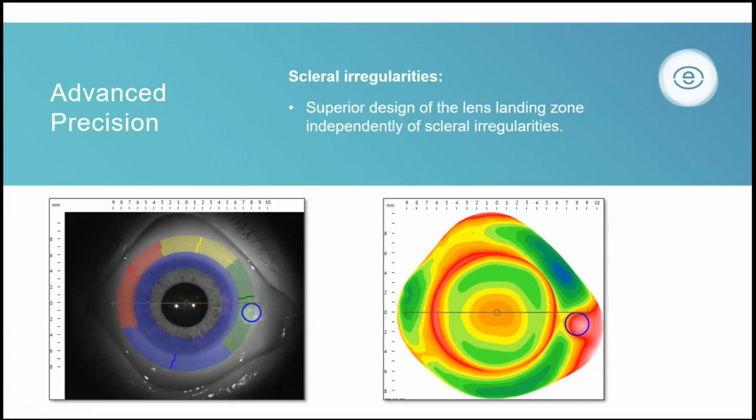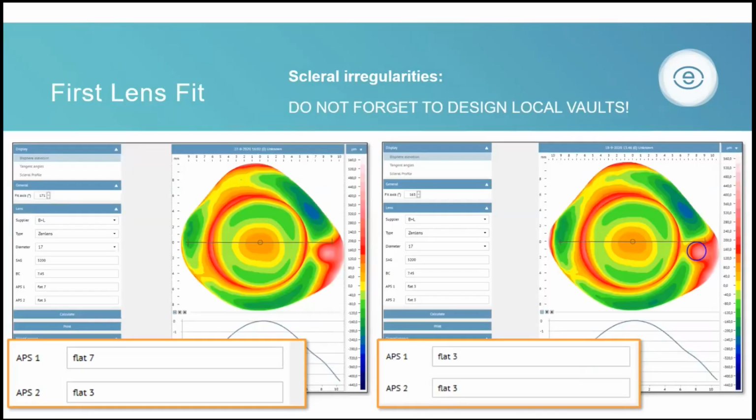Of course, always be aware that we're introducing this now, and we believe that it's really good, although be aware of false positives or false negatives. If you're hitting on such an example, please send it in, because we can only learn. But for now, we really believe it's a strong feature. So what does it do?